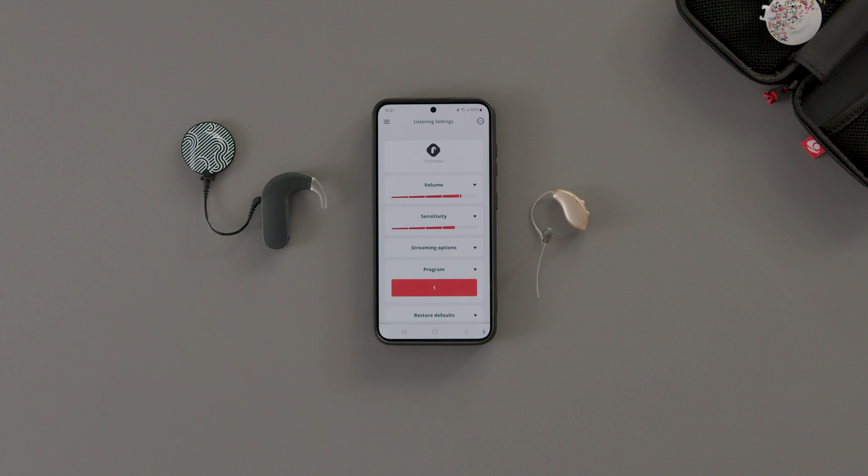Compatible phones with Android 12 and later let you stream sound to Sonnet 3 and an ASHA compatible hearing aid at the same time for bimodal streaming. You can find a list of tried and tested devices at go.medel.com/Sonnet-3-bimodal-compatibility.